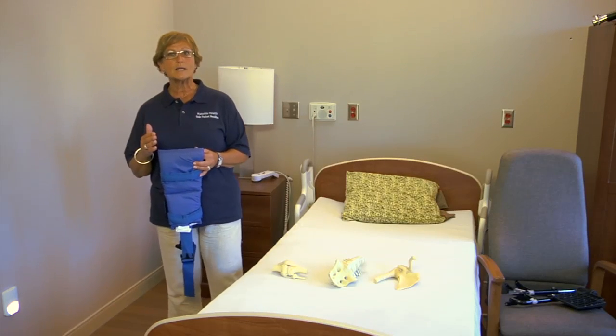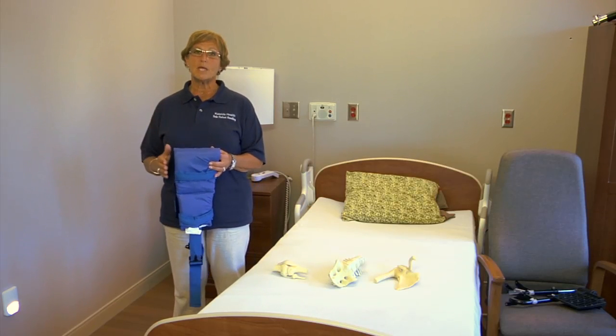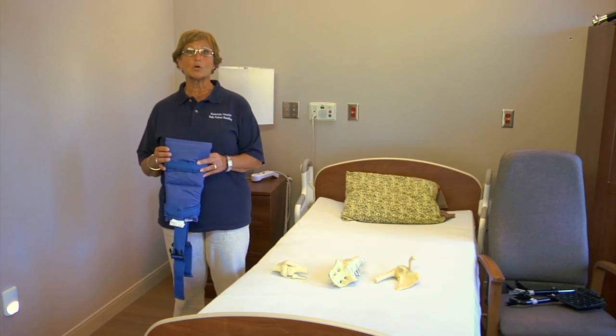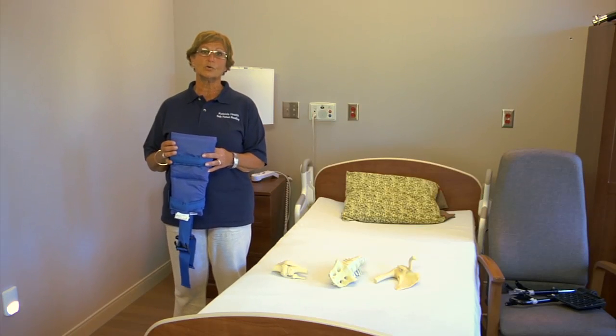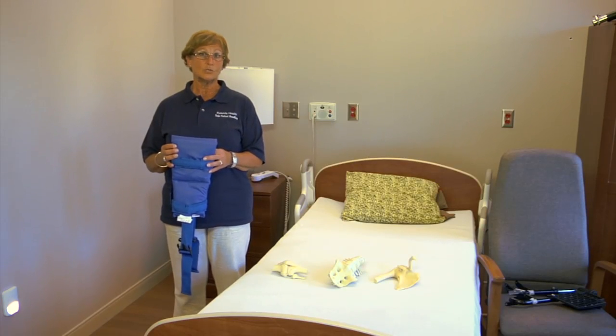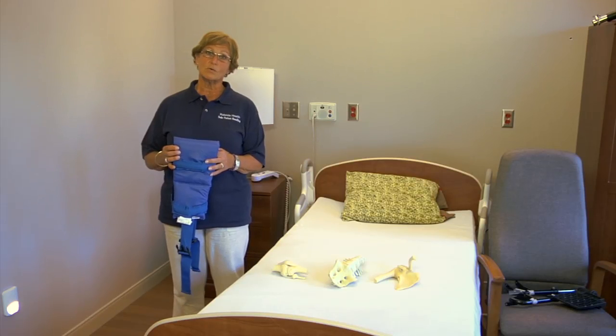So it's important to recognize that it is a manual lift transfer. Even if the gait belt's on, many times we see the healthcare worker go underneath the joint of the shoulder and lift and leverage that load using the shoulder of the patient and using their own shoulder.